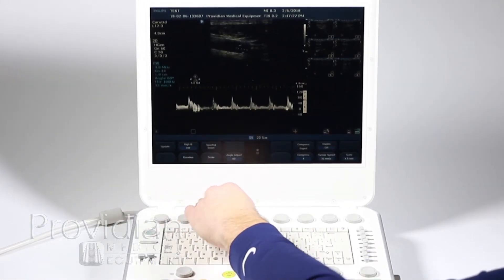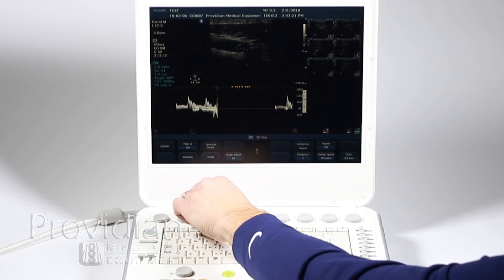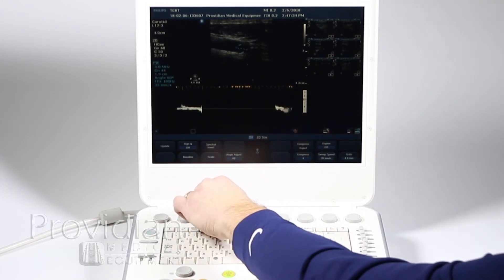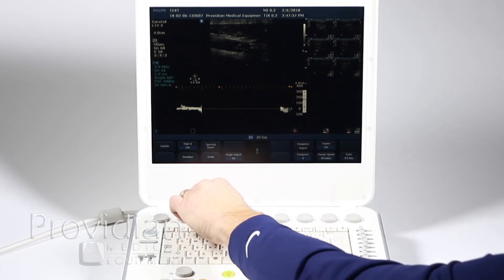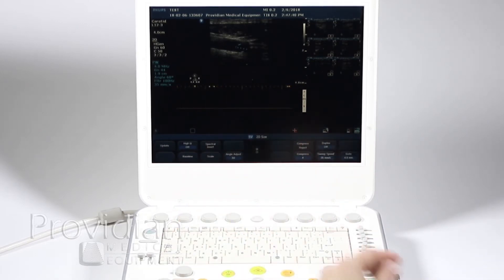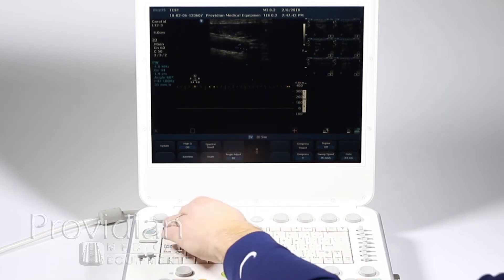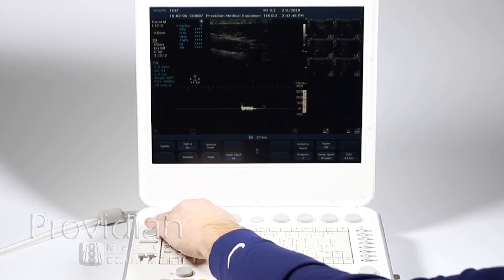Here's the scale, also known as PRF — Pulse Repetition Frequency. You can see that the scale changes over here. Some people know them by opposite names. We also have HiQ, which is an auto Doppler calculation.